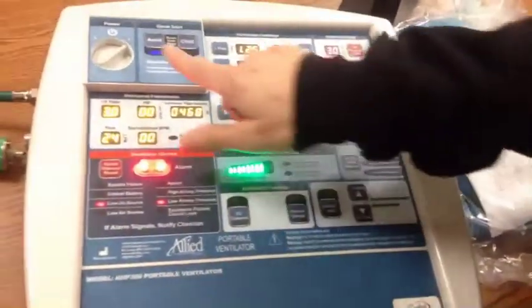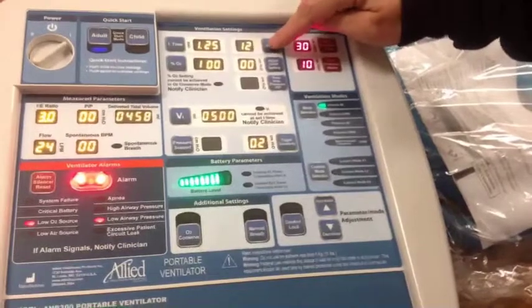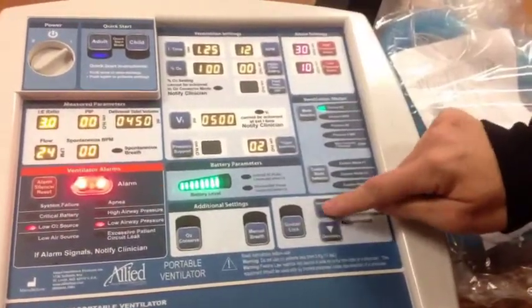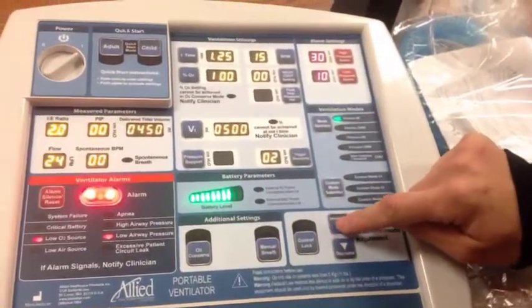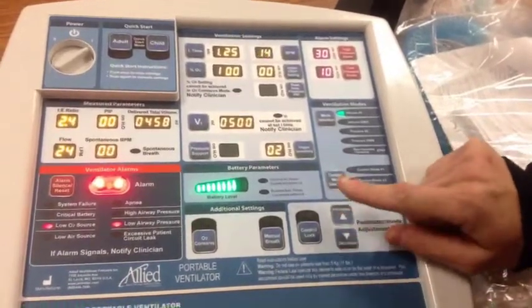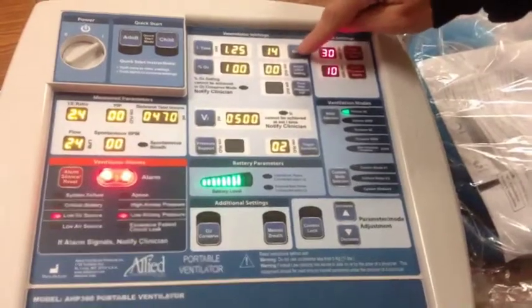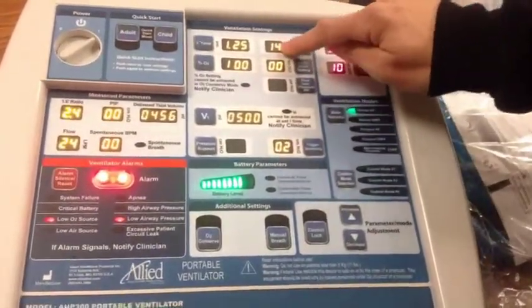So going back to how we adjust the settings, we're clicked in on the adult. If we wanted an AC control of, let's say, 14, we can push the breaths per minute and then go down here to an increase-decrease button. So we can increase the breaths per minute or decrease. For the purpose of this, let's leave it at 14. Now since we changed that, we go back to the BPM, breaths per minute, and push it again. Now that it's not blinking, it's locked in there.